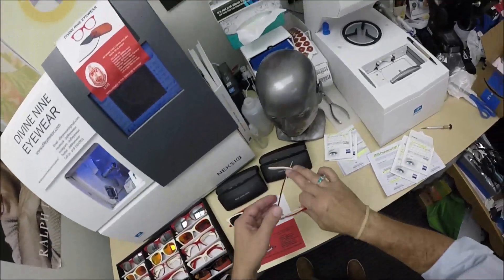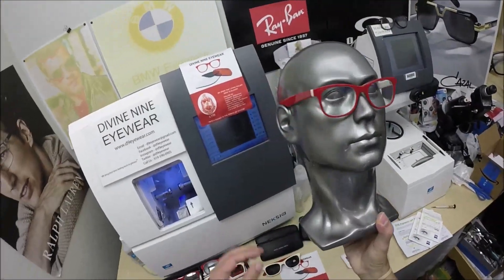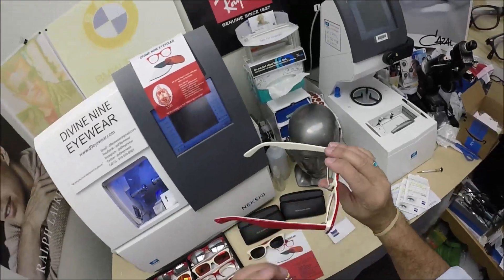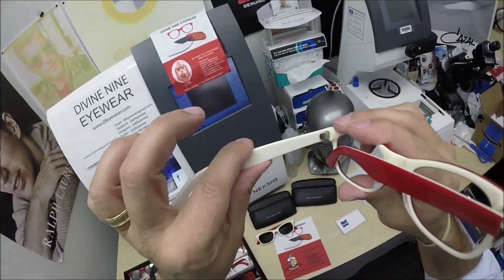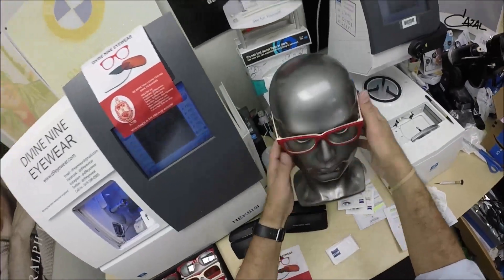Let me show you what these look like on — I know I need a better model, but this is what I have today. Classic styling, Italian acetate. By the way, German Monell metal hinges — OBE, which is the brand of German engineering for the hinges — the strongest plastic you can get, the strongest hinges. That's what they look like on.